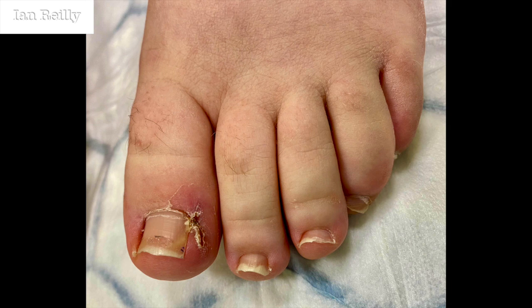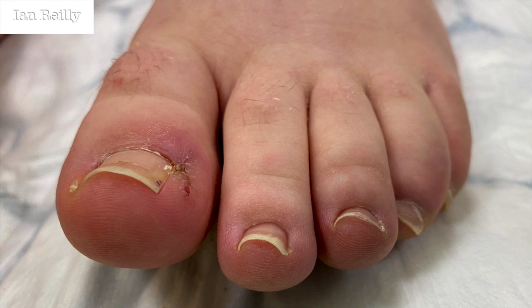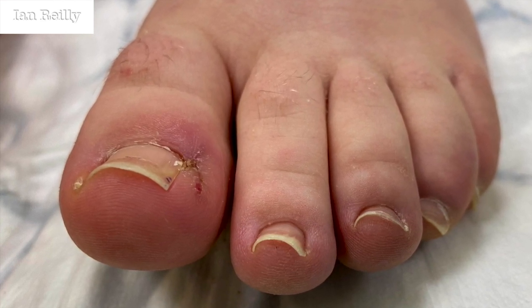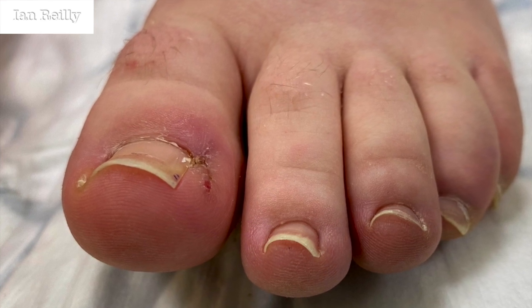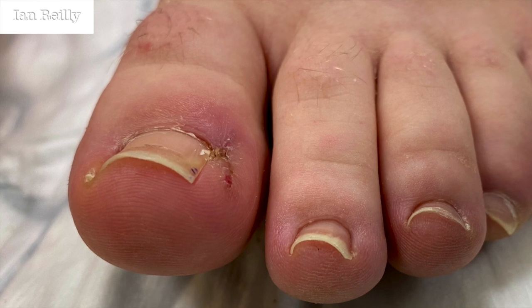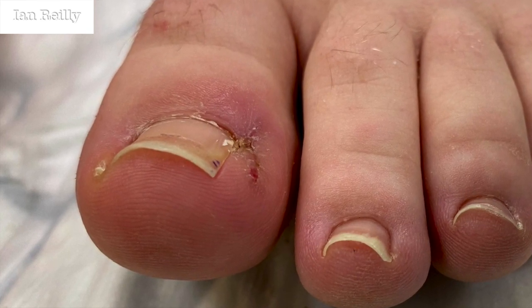And as I come in just a little closer, this is after I've tidied up the scab, a bit more of an apical shot, and you can see that's healed really nicely. And again, just to point out, on that lateral aspect of the sulcus, there's some swelling from the cryptosis and also my surgical trauma that will reduce with time.